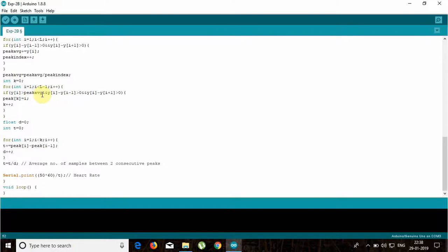And now we will calculate the number of peaks which are useful to us, which are more than the threshold value, and we will store those sample numbers in an array peak. With this loop, we will calculate the average number of samples between two consecutive peaks.